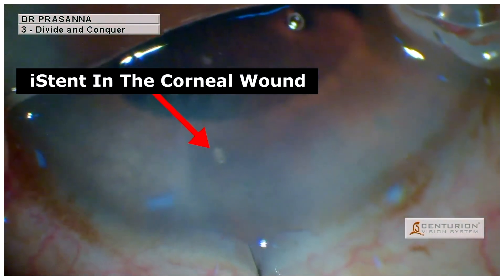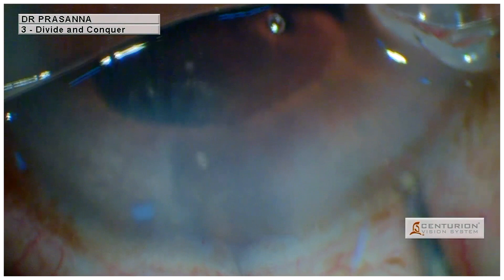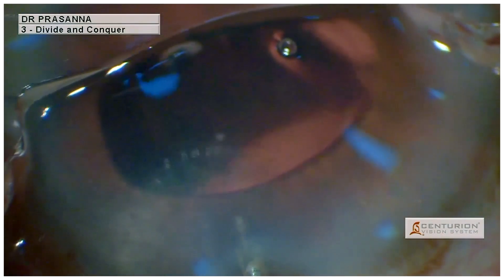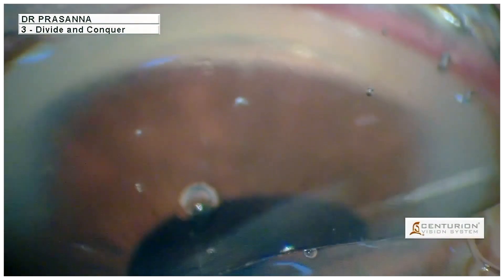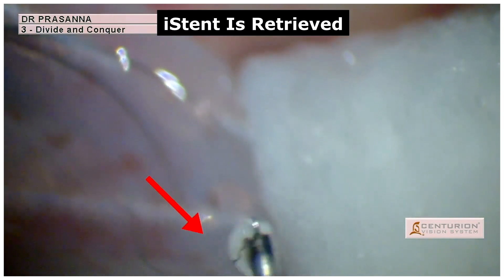The iStent was found within the corneal wound. And again, a re-attempt at retrieval was done by re-threading the iStent into the trocar. This time, there was complete closure of the trocar by the sleeve before removing it out of the eye. Here we can see a re-threaded iStent in the trocar.